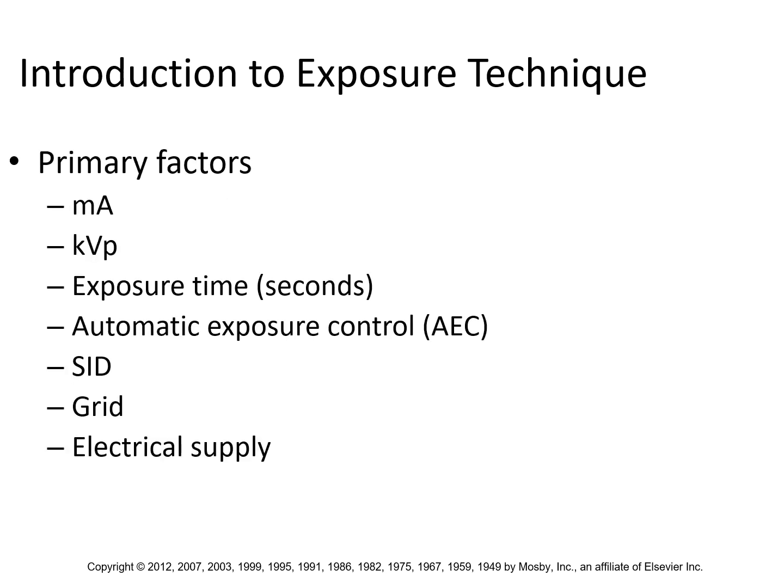So your primary factors: tube current, mA, exposure time in seconds, kVp. Are you using automatic exposure control? Now, I said I would not teach you that because it will confuse you. Well, I'm going to tell you the quick version of it. It's exactly what it sounds like. It's a sensor that automatically terminates the exposure.